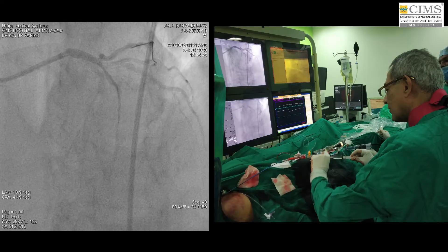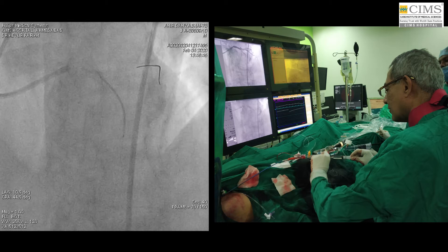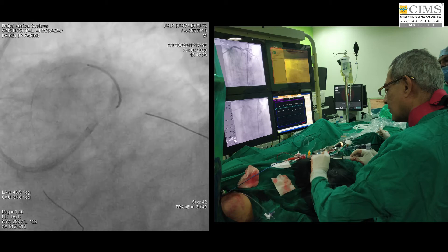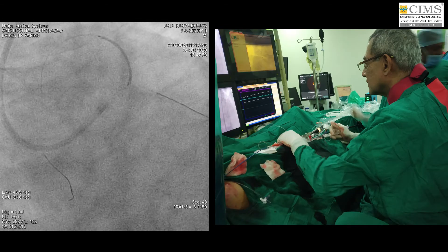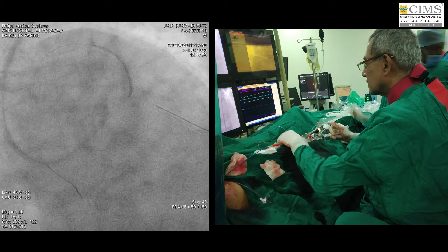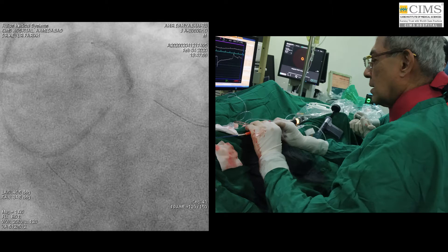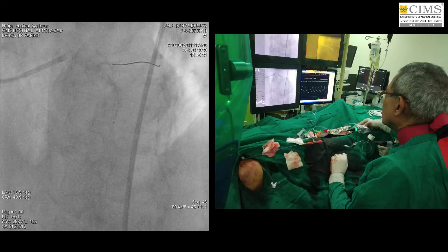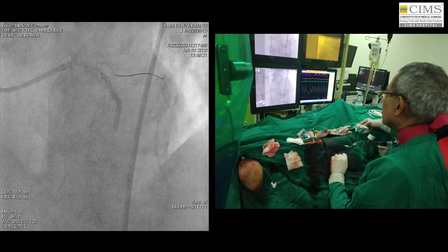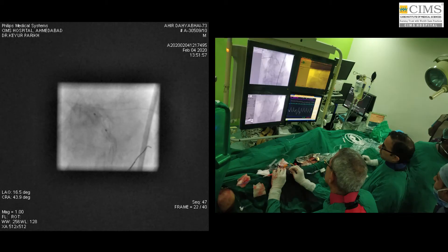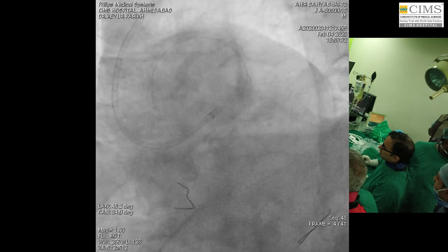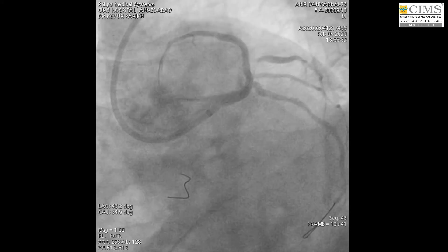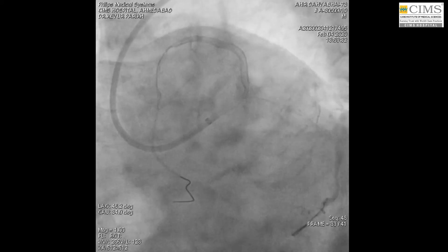OCT is helping us decide the length of the stent and diameter. We are using a 2.75 mm Onyx DES, 38 mm long. The stent was able to cross the calcific lesion easily without need of post-dilatation after IVL. IVL was able to help us soften the entire artery, and even the stent inflation went very smooth. This is very different from before, when the previous operator was unable to cross with the stent.